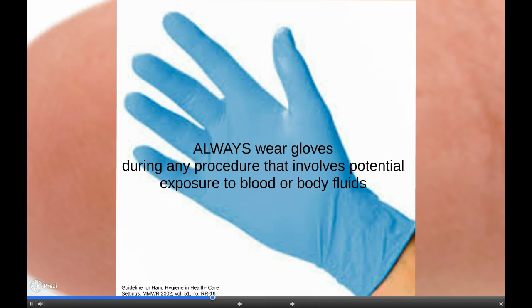Gloves are worn when there is potential for contact with blood, such as when drawing blood or starting an IV, other bodily fluids, mucous membranes, non-intact skin, or contaminated equipment. Always wear gloves during any procedure that involves potential exposure to blood or body fluids.